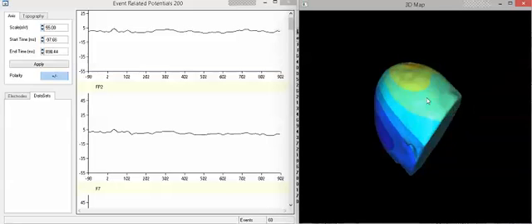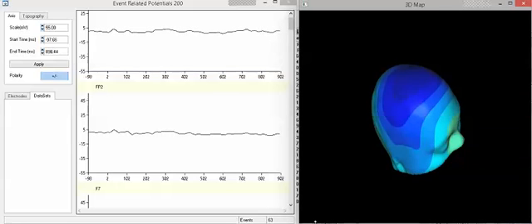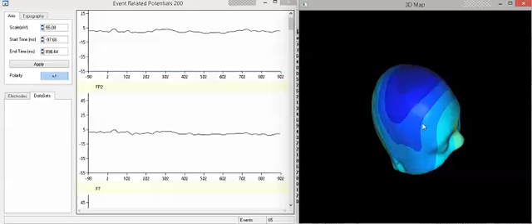There you can rotate the model. You can see the electrical potentials shifting and changing. And one can stop the evoked potential and evaluate it at any particular time, at any particular latency.